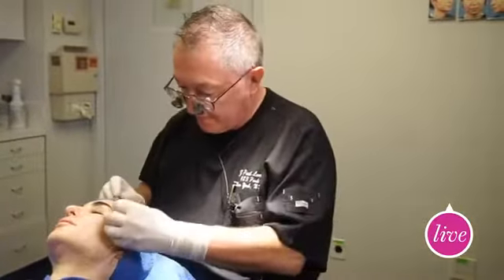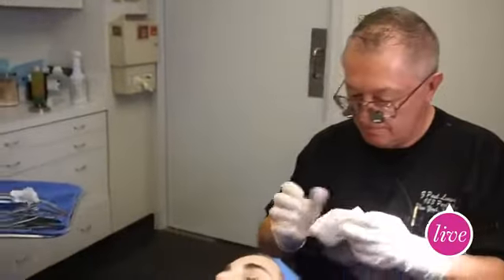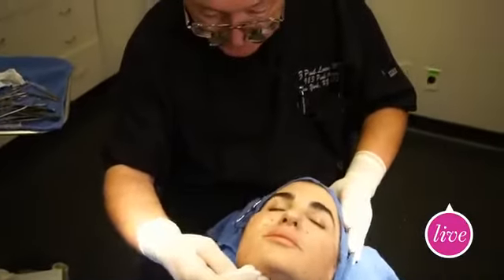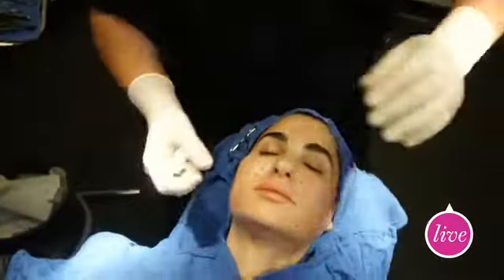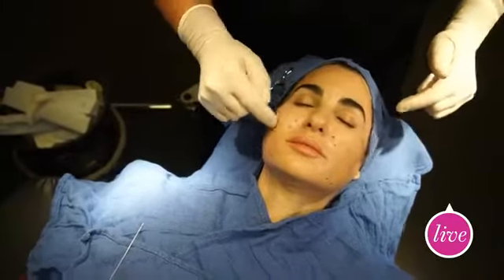So before you go into the next suture, maybe if we could just show a before and after of the one side. I know we did one suture on the other side, but the other side is completely done. Straight and just gently, okay. See if you can appreciate, but you can see all of the tissue from here has been moved up to here.